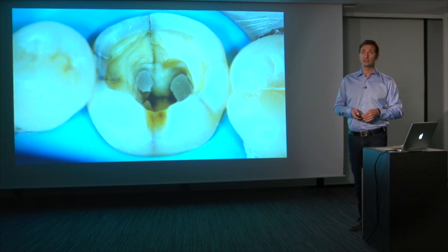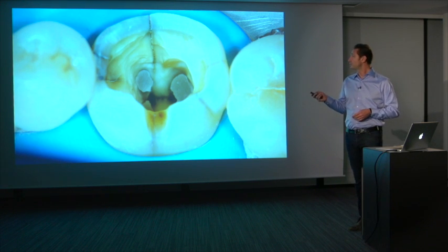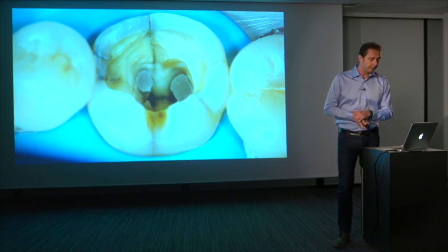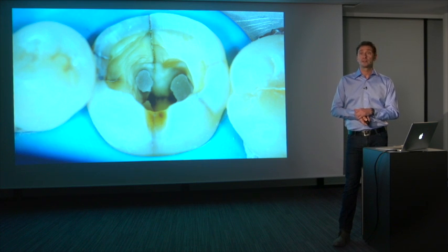It may even lead to complete failure of the restoration tooth complex with loss of vitality, as you see here, and maybe even loss of the tooth, because in this case the fracture is really going deep into the root canal system. So this patient is informed of the very low chance of survival.